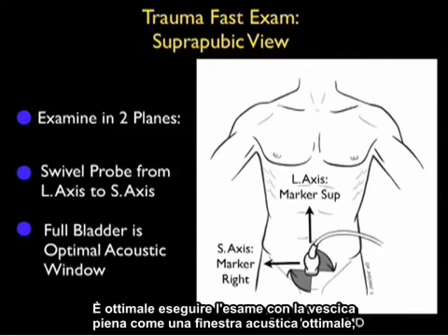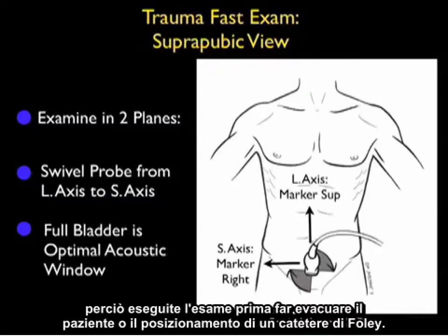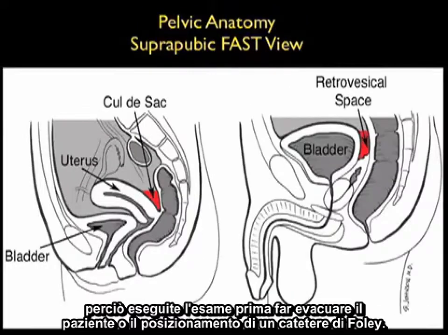It's optimal to perform the examination with a full bladder as an optimal acoustic window, so perform the exam prior to having the patient void or placing a Foley catheter.